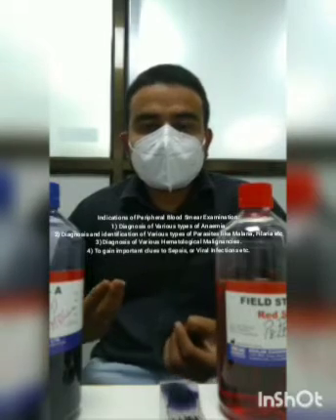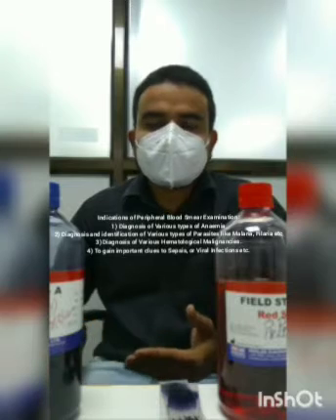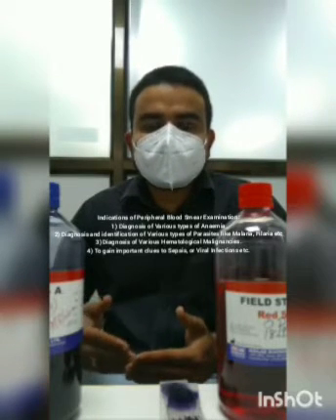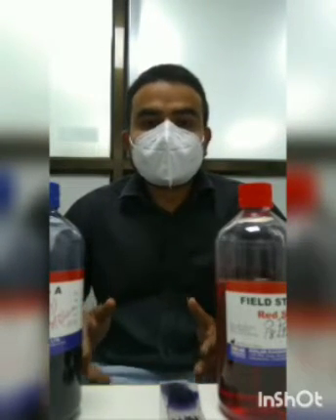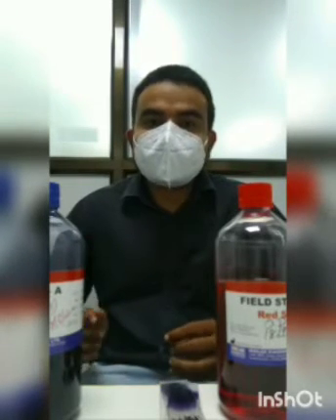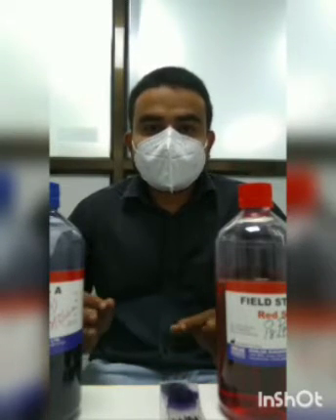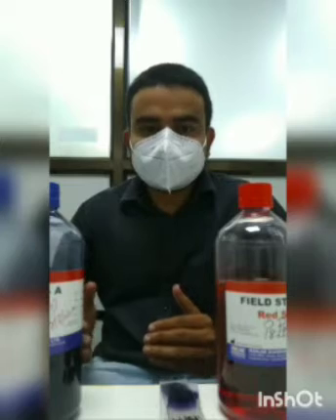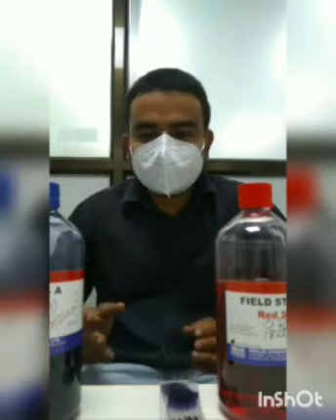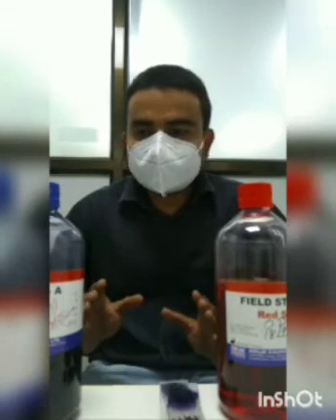Some hematological malignancies such as leukemias and lymphomas can be diagnosed and further investigated through peripheral blood film. Certain parasites, for example malaria parasite and filaria parasites, can be easily visualized under the light microscope using a properly stained peripheral blood film. So staining plays a very basic and important role in the process of diagnosis.